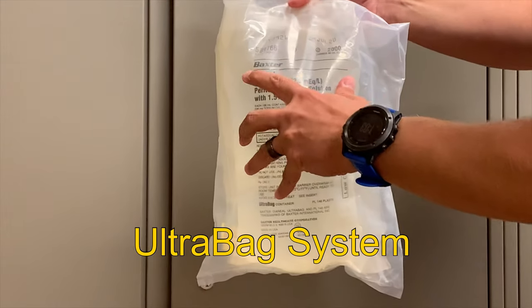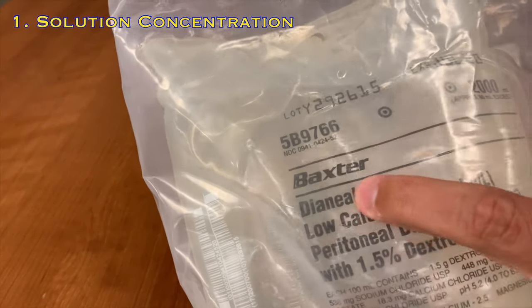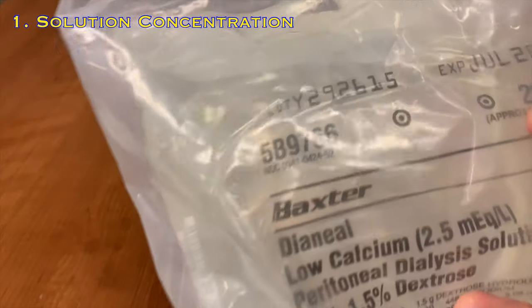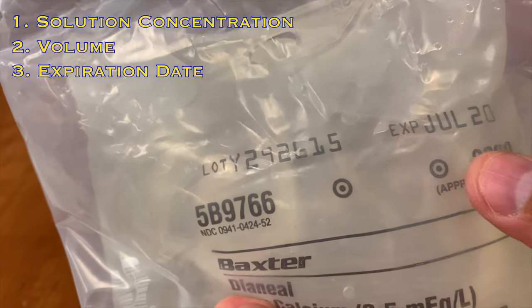With your fluid warmed, take your dialysate — also known as the UltraBag system — into the room. Prior to administering any dialysate, you will always need to inspect the full UltraBag system. Begin by matching the information in the order to that of the bag, starting with the solution concentration. This is a 1.5%, followed by the volume — this is 2,000 milliliters — and then ensure that the expiration date is still valid.